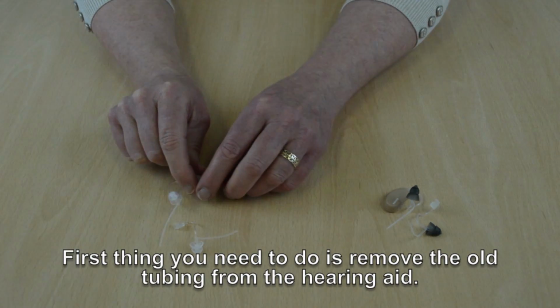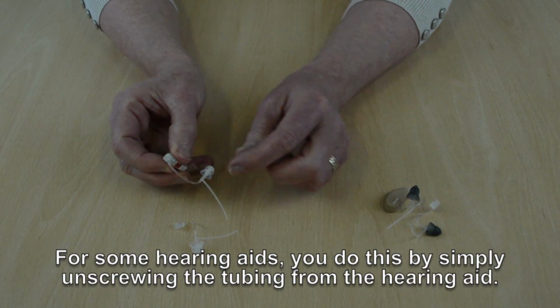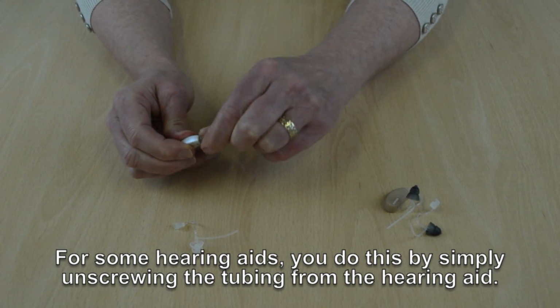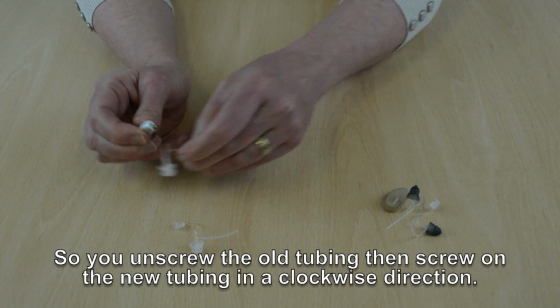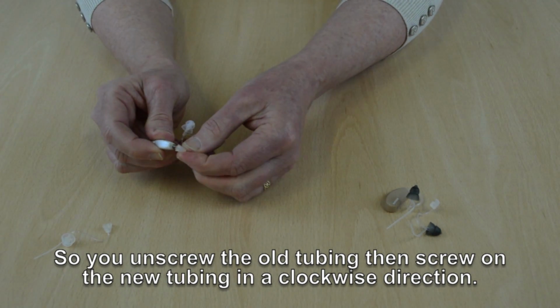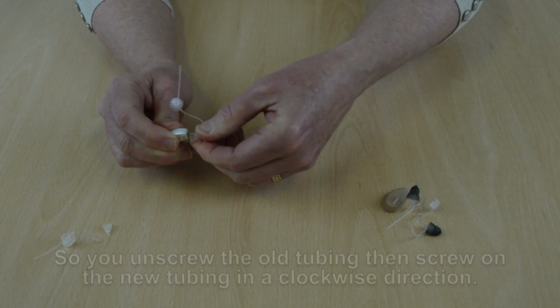First thing you need to do is remove the old tubing from the hearing aid. With some hearing aids, you do this by simply unscrewing the top of the tubing from the hearing aid. So you unscrew the old tubing and you screw on in a clockwise direction the new tubing.